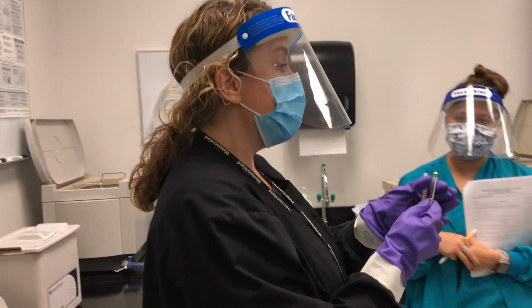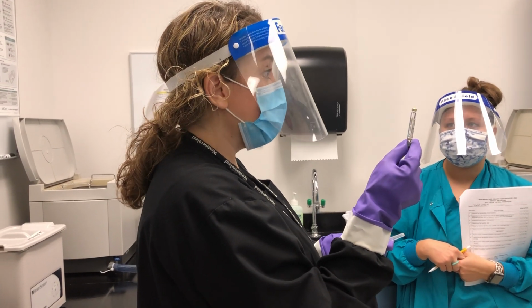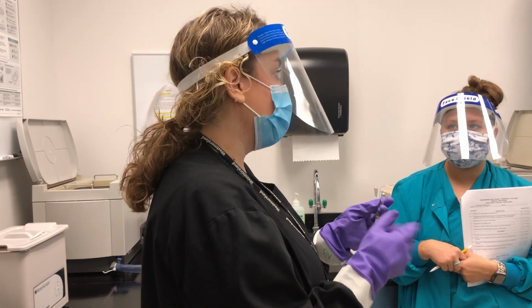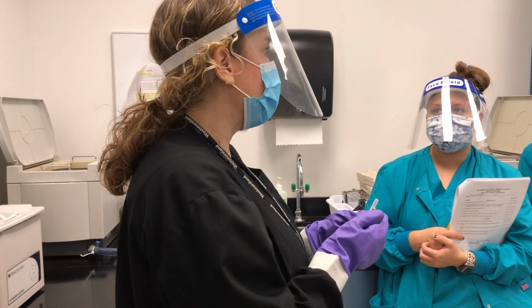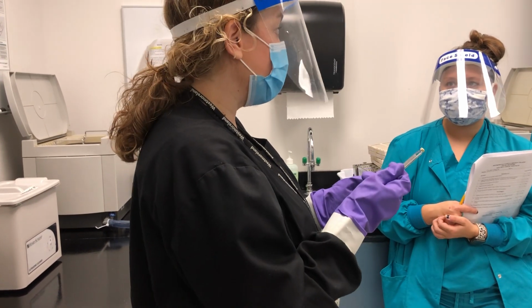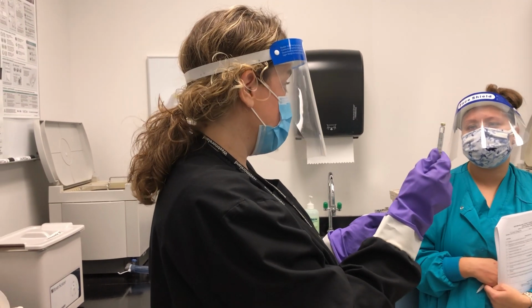Okay, so there's one more thing on here that came from the anesthesia. This is actually the carpule of anesthesia. It's made of glass. So if we threw this in normal trash, that could end up injuring wildlife in the oceans, they say. It can obviously break open and cut somebody that handles the garbage, okay? So we want to make sure that this goes in sharps as well.